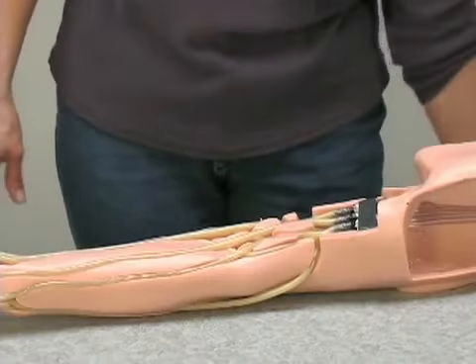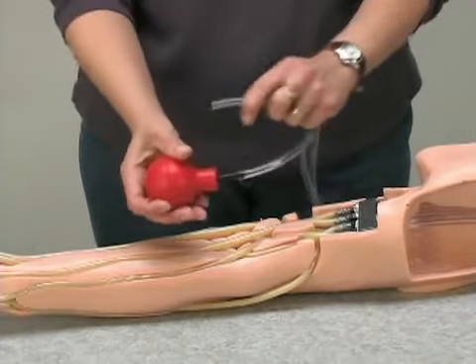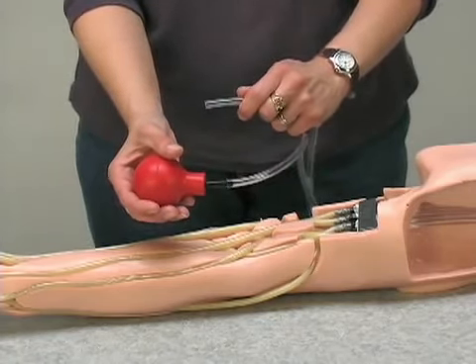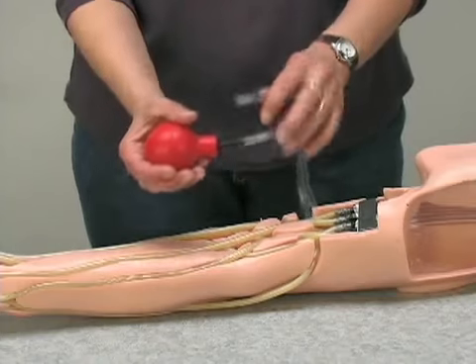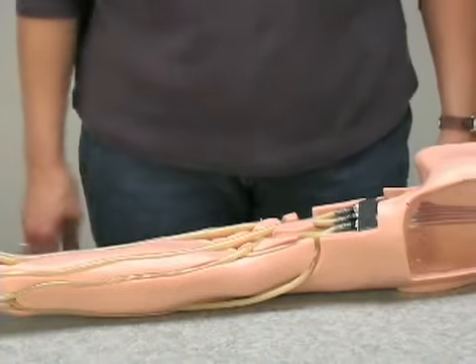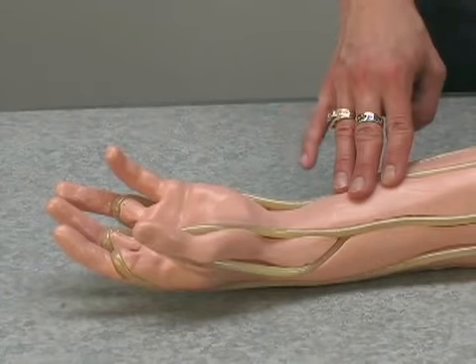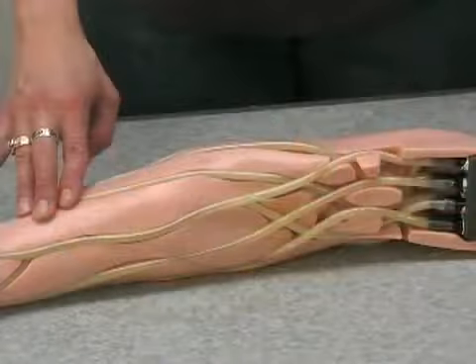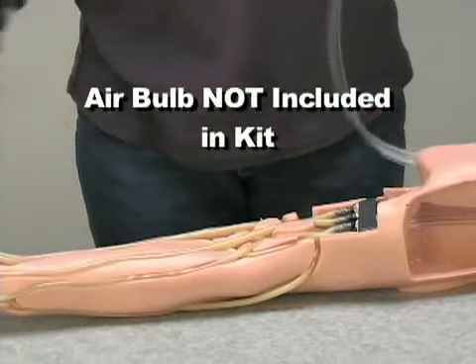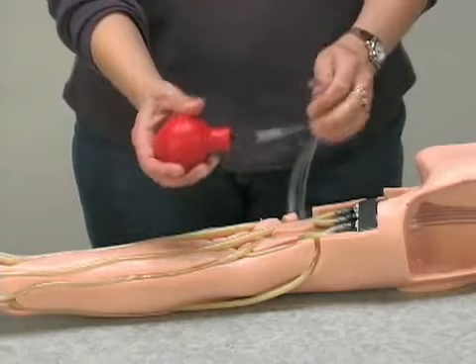Next, check to ensure proper flow through the arm by taking the clear inlet-outlet tubing coming out of the shoulder. Either blow or pump air into one tube and feel the flow from the other side. This ensures the arm veins are free of obstructions or pinches. If you cannot feel the flow, check for pinching of the tubes around the fingers and in the arm channels. The air bulb is not included in the kit. Either use your own or blow into the tube with your mouth.